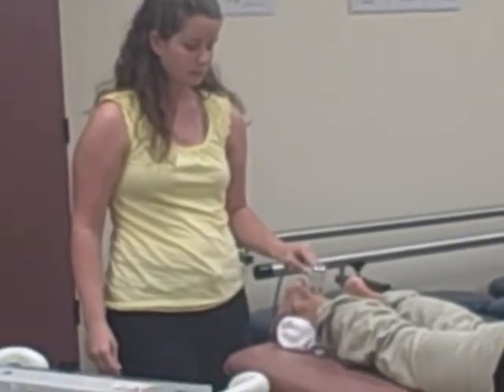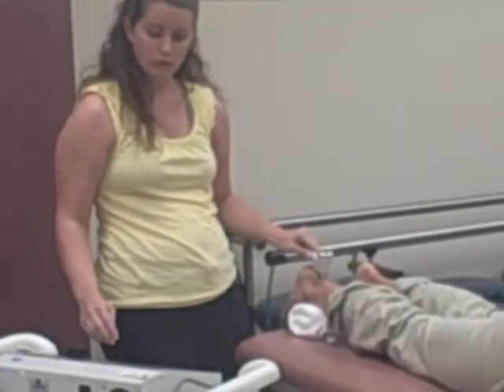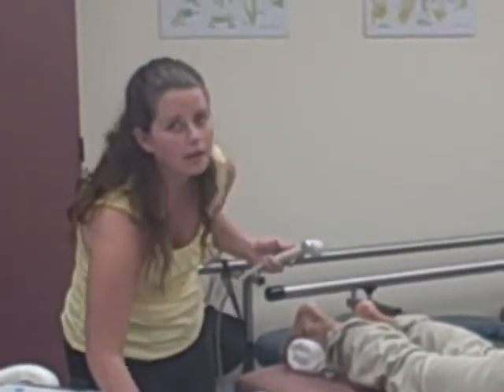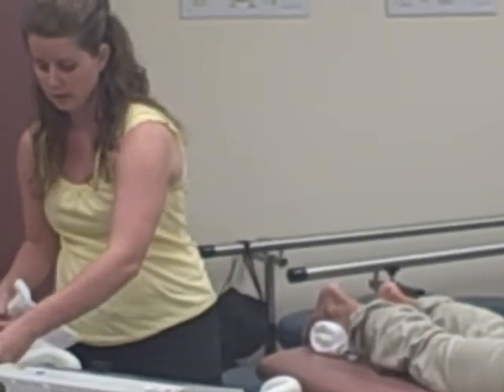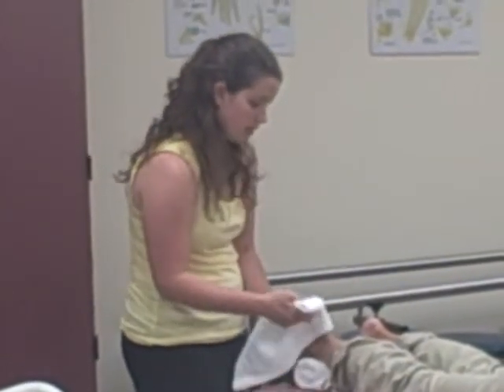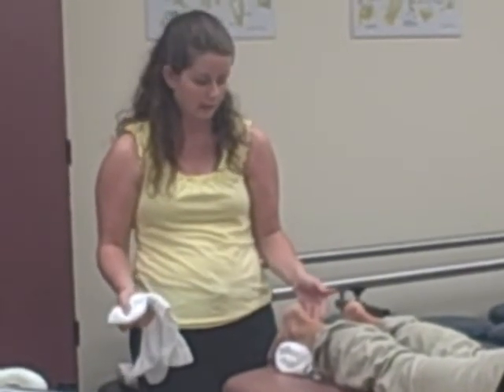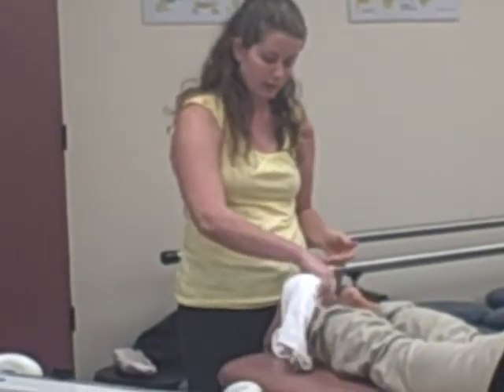And then when we're done with treatment, we're going to turn the machine off and then take the head off. After we take the head off, we're going to wipe that down, put it back, then wipe off her ankle, and reassess. Our expected outcomes are that the tendon will heal quicker and that the surgical incision will be less red, so we just reassess the skin, make sure it's good, and then we document. And that's how you would do post ultrasound.